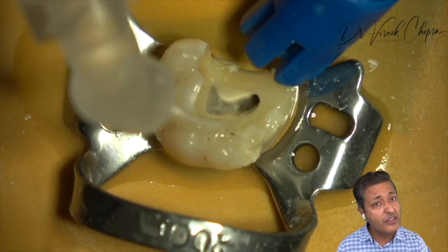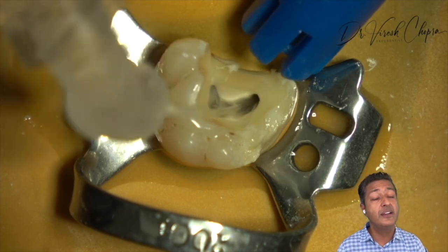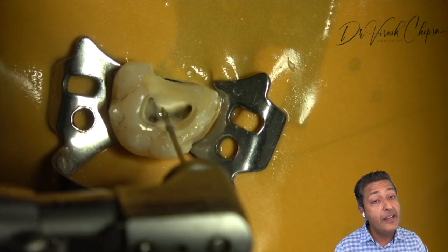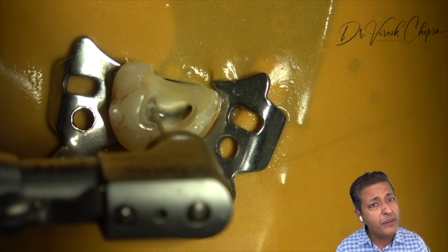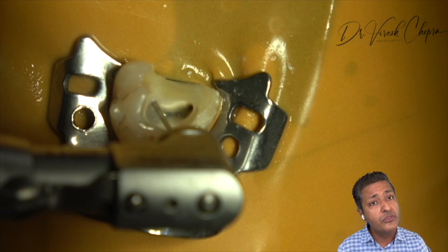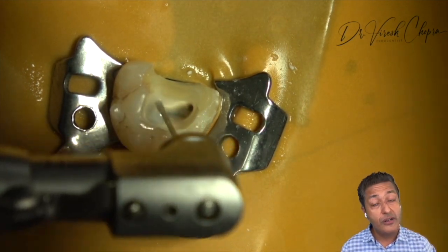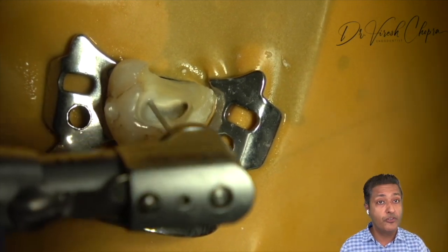There are high chances that if we are not able to use the GG drill in the correct way as prescribed, then we might cause a perforation. So therefore, gently place a GG drill, use it in a circular motion to widen the orifice, and then use it by taking it from the inside to outside direction, not otherwise. Otherwise we will be causing perforation there.